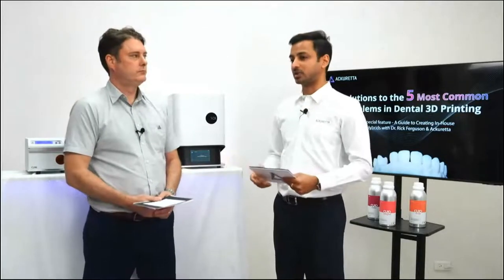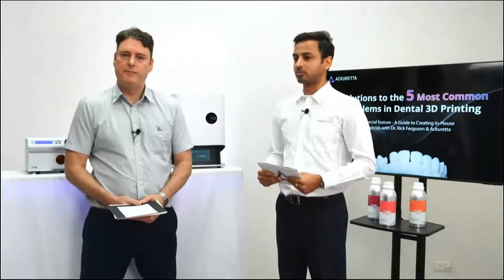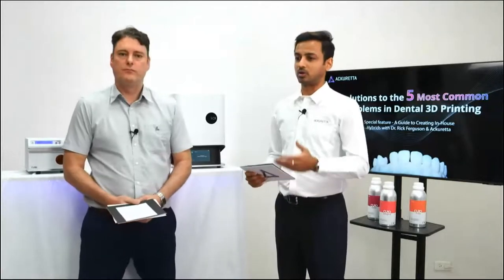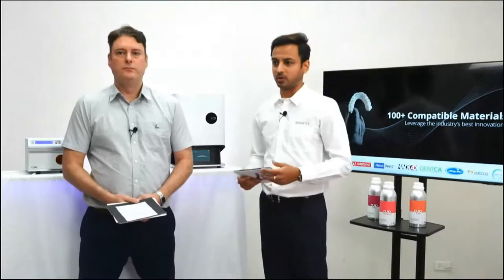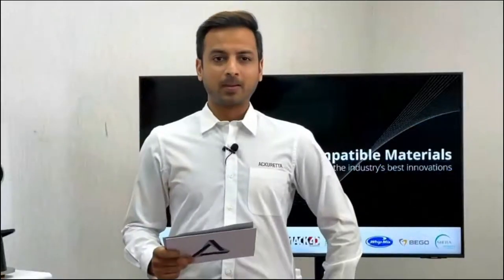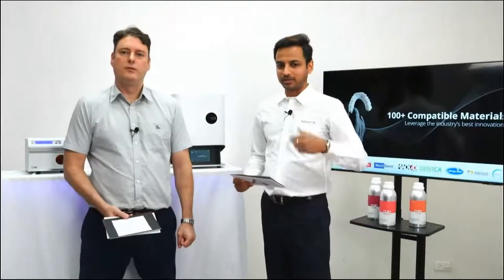The second one is from Saremco Dental. It's out of Switzerland. It's a little lesser known, but actually the quality is right up there with the Bego materials. It's called Saremco Crown Tech. So these are the only two materials that we know which have certifications in the market for permanent restorative applications. Super, let's keep them coming.